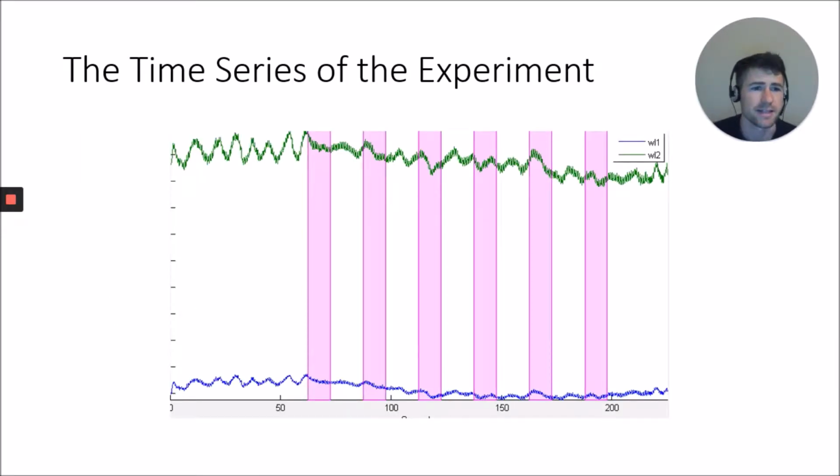What this looks like as a time series is basically this. We have about 220 seconds of data here, and we have 2 data streams coming in. These are each wavelength of data for a channel mean, so it's all channels averaged together. It doesn't tell you that much information, but it gives you an idea that there's data coming in.